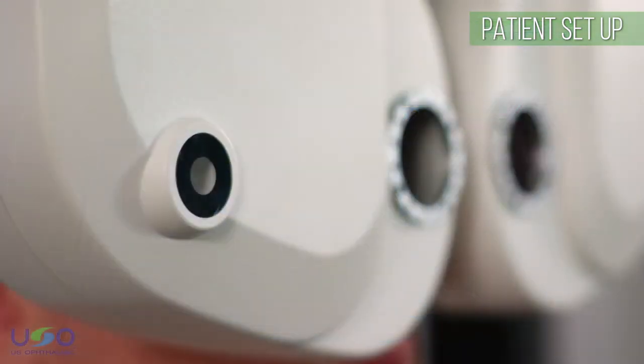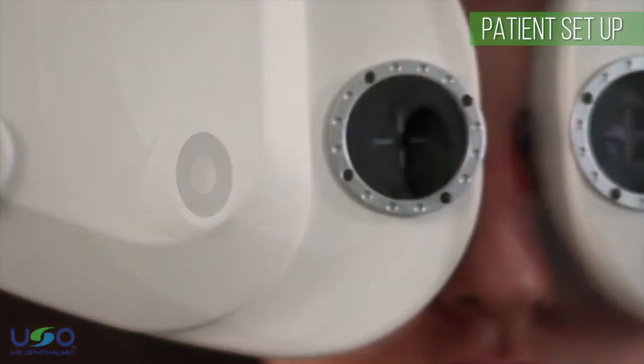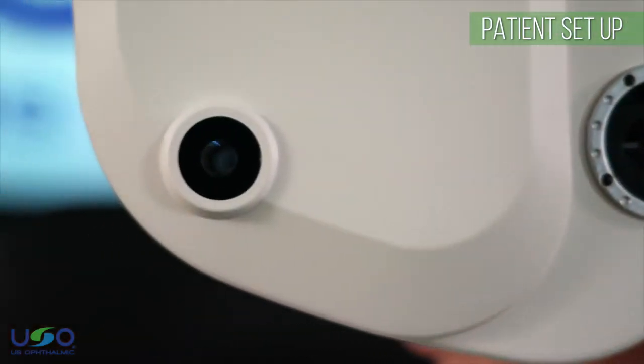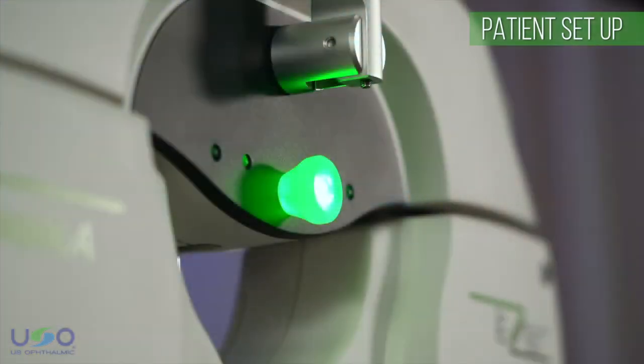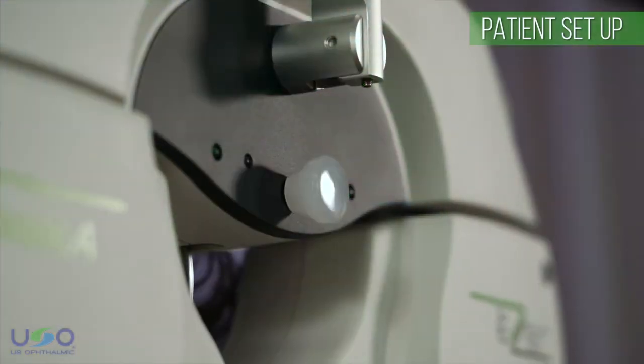The vertex distance checking windows allow the professional to position the patient in the proper vertex distance, resulting in more accurate results. The digital refractor has a sensor that allows you to constantly monitor if the patient is at correct vertex distance to avoid refraction errors due to poor positioning.